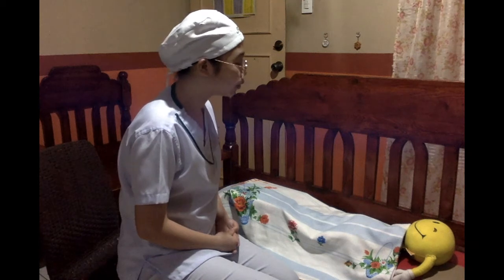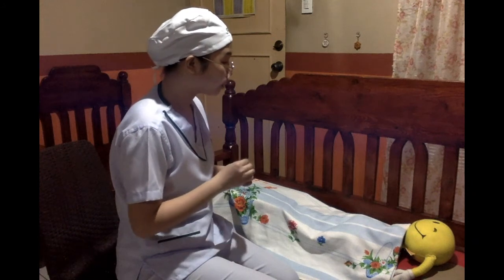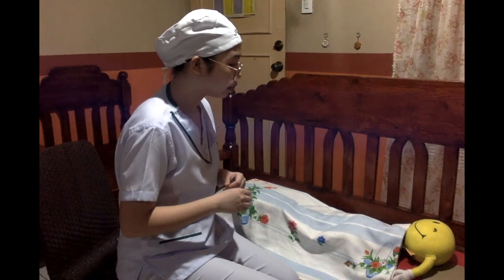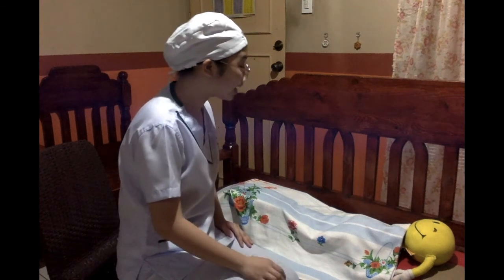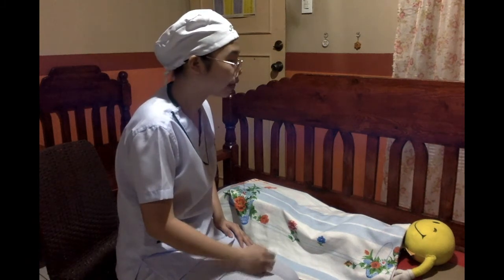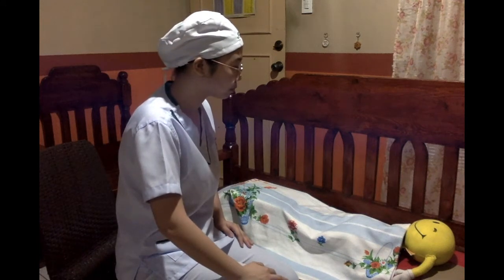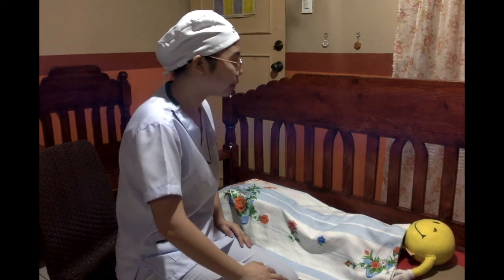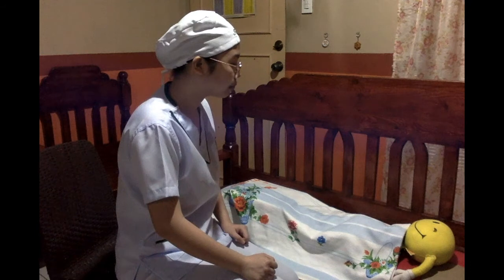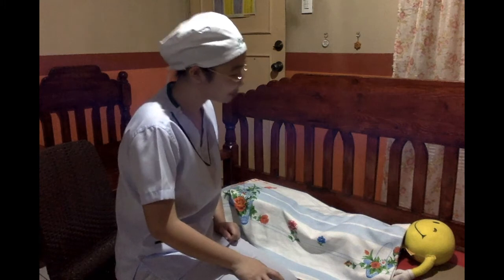Yung mararamdaman nyo po. Habang pinapasok ko po yung catheter, or yung manipis po na tubo, may mararamdaman po kayong parang pressure po. Opo. Pero aalalayan ko naman po kayo. At saka sasabihin ko rin naman po sa inyo yung mga kailangan nyo pong gawin para mas maipasok natin ng mas mabilis at mas madali po. Opo, kagaya po ng iiri po kayo ng kaunti habang pinapasok ko po at hihinga po ng malalim para po ma-relax po natin yung mga muscles nyo po dito. Opo.